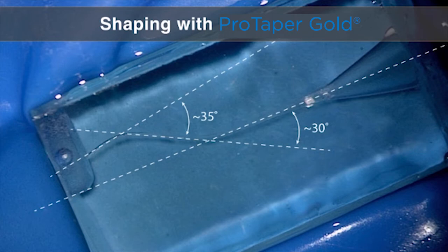Normally, we would clinically use a viscous chelator as we begin to do our glide path procedures, but in plastic we'll just use 70% isopropyl alcohol. Notice the access is done, and we'll just use the straight internationally most utilized files — purple, white, yellow, red. That means we won't use SX in this case, but we would clinically if it was a lot longer block, and that would really help us achieve length. So just use the S1, the S2, and then two finishers, F1 and F2.